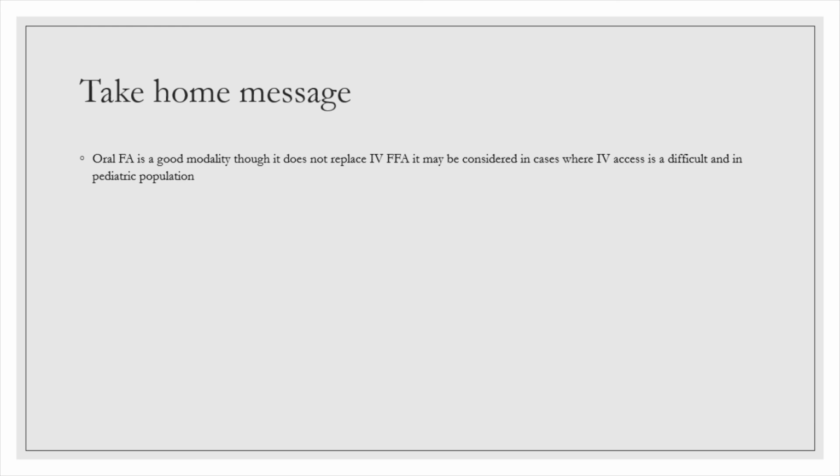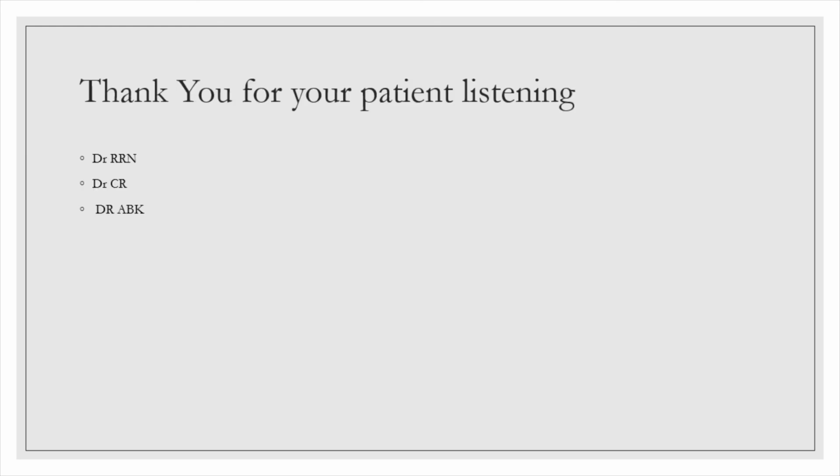So my take-home message is oral FA is a good modality, though it does not completely replace IV FA. It may be considered in cases where IV access is difficult and is of much use in pediatric population.